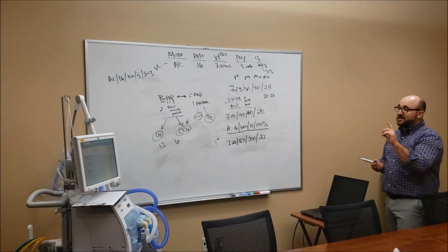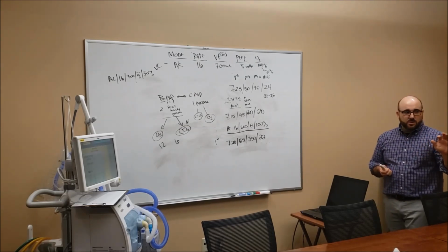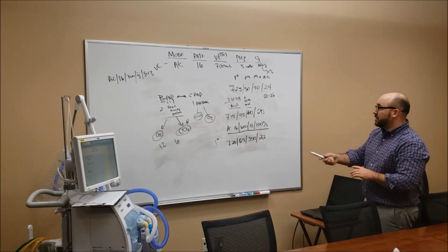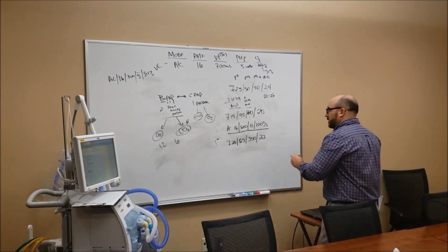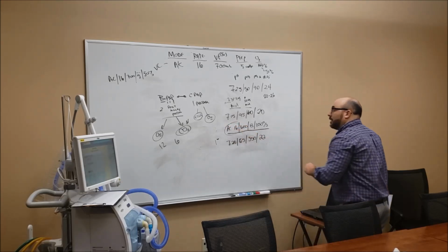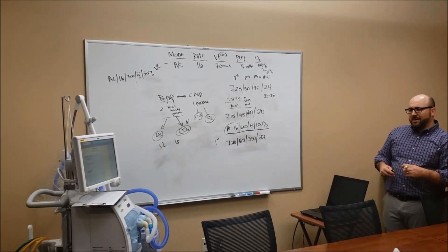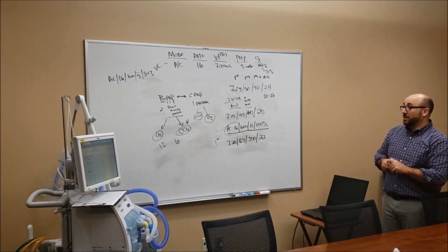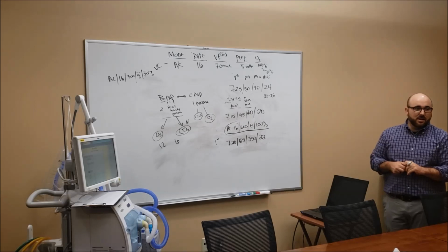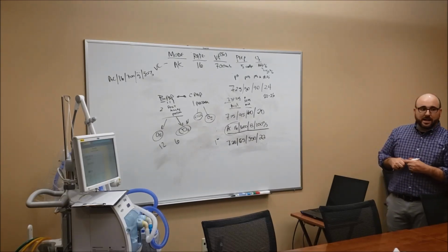Absolutely. The fastest way is to increase respiratory rate. So always in the ER, that's what you're going to be doing. You could also increase the volume you give them, but the fastest way is going to be respiratory rate. So they're probably going to give you an increase in respiratory rate because right now, although it's working, an hour later, you should be able to get them back to normal. You should be able to get them back to normal within 30 minutes on a ventilator. So increase respiratory rate because that's what they need right now.